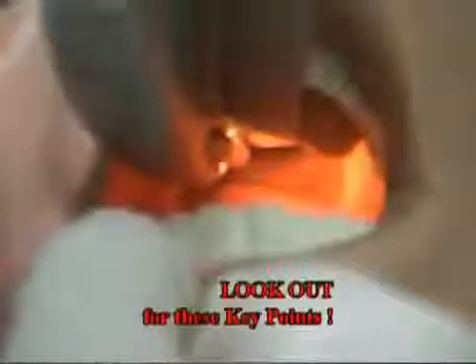Advance the laryngoscope blade until the epiglottis is visualized. Put the tip of the blade into the vallecula, and when the tip of the blade is correctly positioned, lift the laryngoscope upwards and forwards at a 45-degree angle, directing the force of your lift along the axis of the laryngoscope handle. Avoid bending your wrist or rocking the blade against the patient's teeth, which can cause damage to the teeth or soft oral tissues. Hold the endotracheal tube in your right hand while maintaining the view of the vocal cords.